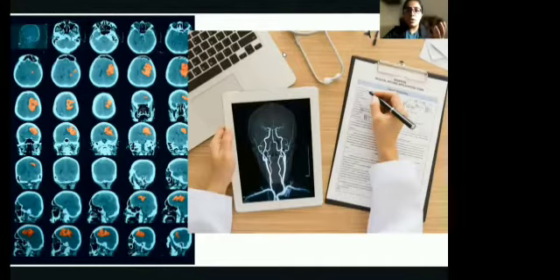So you saw the infarct, you know where the infarct is coming from, you trace the vessel, you can also trace the aorta, you can go ahead and do your echo stuff to know if it's of cardiac origin. Once you know that, you immediately come to etiology. You can have atherothrombosis, atheroembolism, you can have lacunar infarcts, from hypertension, etc. The whole management is a very linear driven approach.